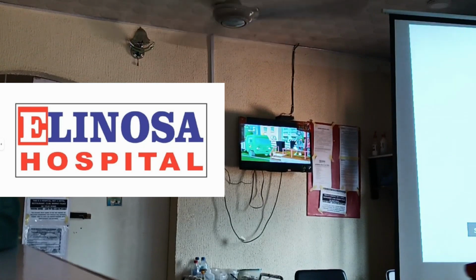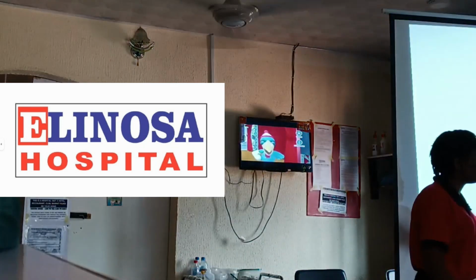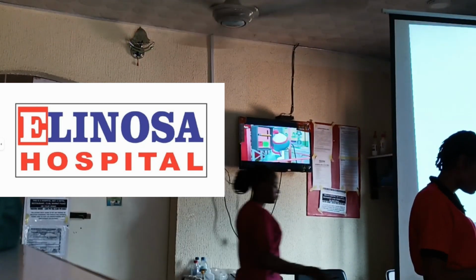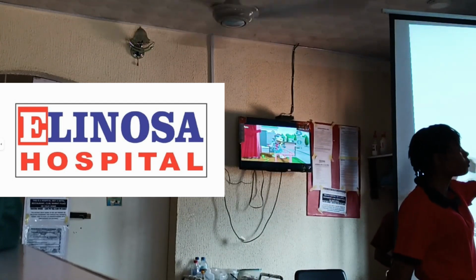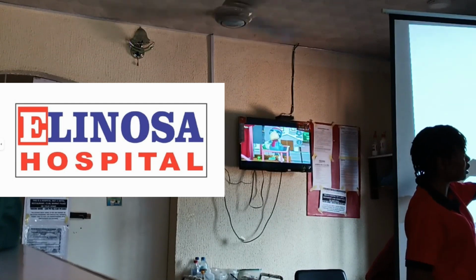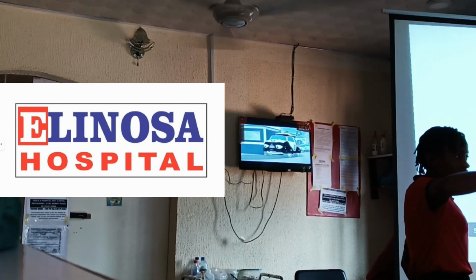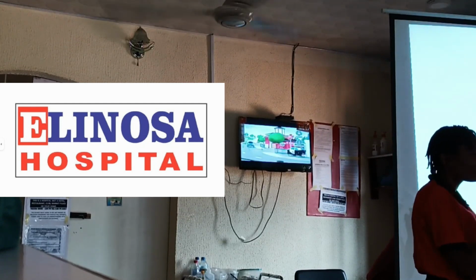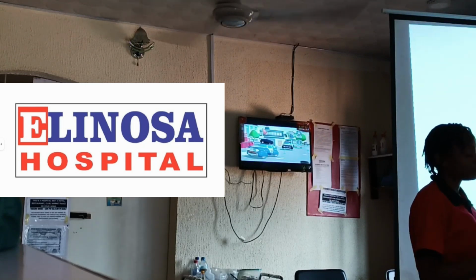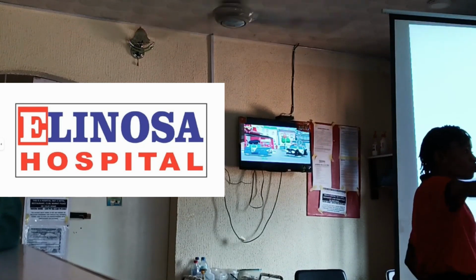But we have lots of different types of anticoagulants. This one is fluoride oxalate, it is an anticoagulant. This one is EDTA, and this one is lithium heparin. So when you layer your blood inside this EDTA container, you don't shake like this to mix. You mix by gentle inversion, because the blood is very fragile. By the time you start shaking, it will rupture and be destroyed. Are you getting it?